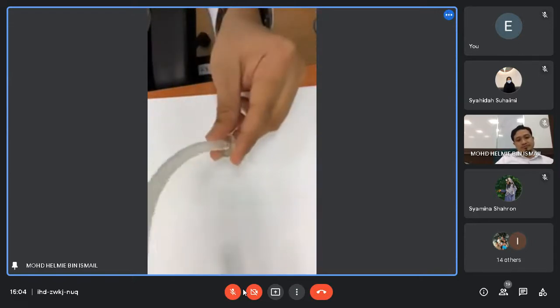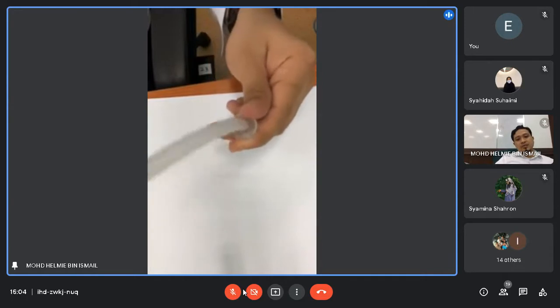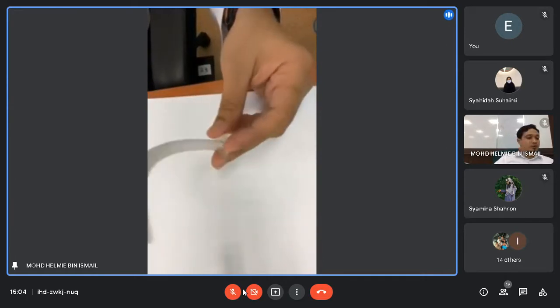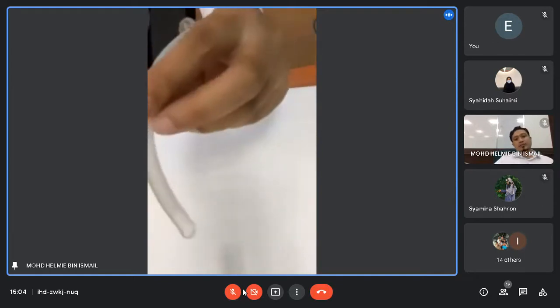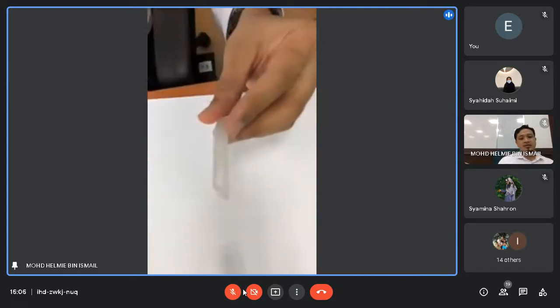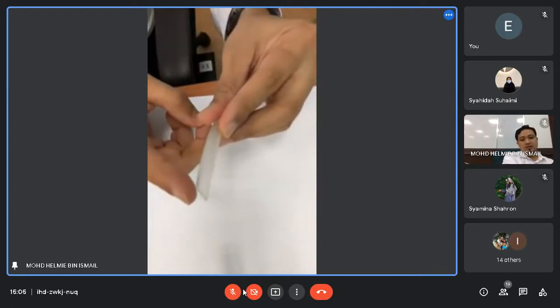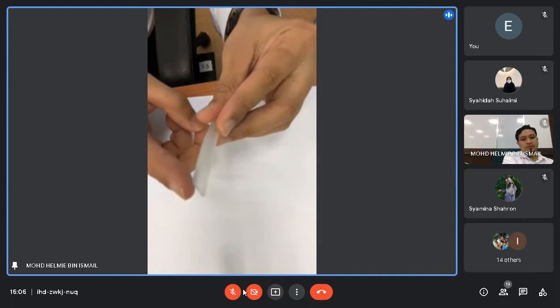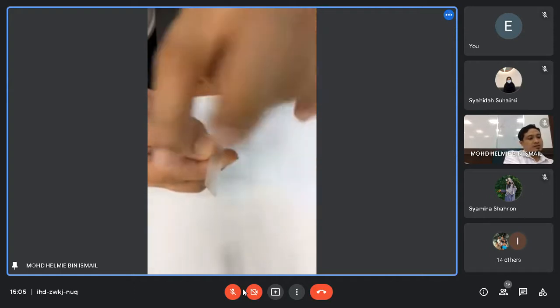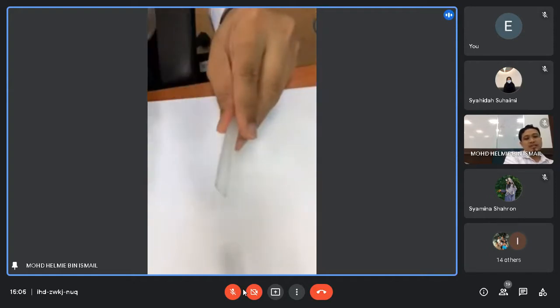Alright, for this one. For the nasopharyngeal airway, how you insert is you must first be gentle. And this one, you know, is the bevel or tip of the nasopharyngeal airway adjunct. Basically the bevel should be outside, lateral to the patient's nostril.